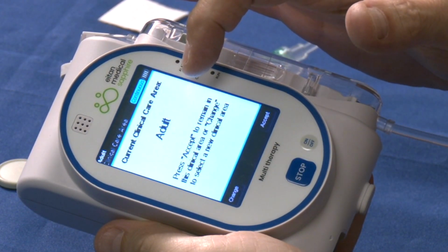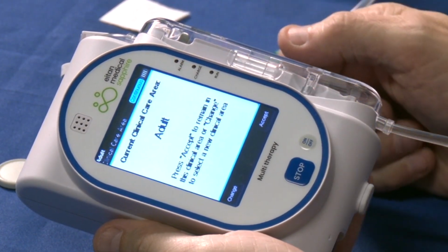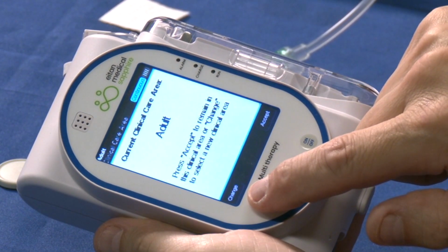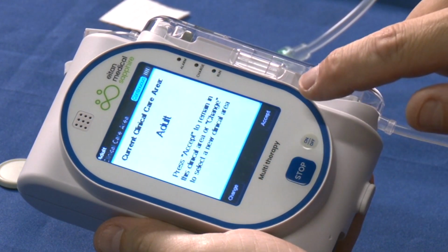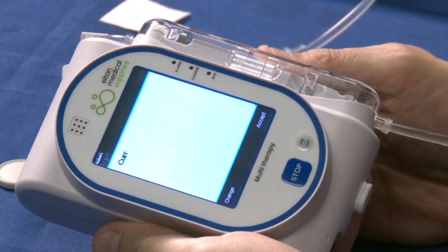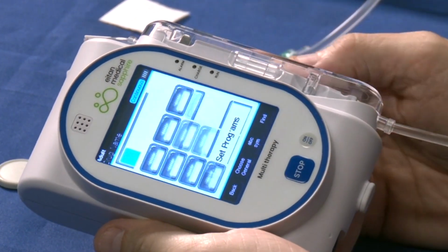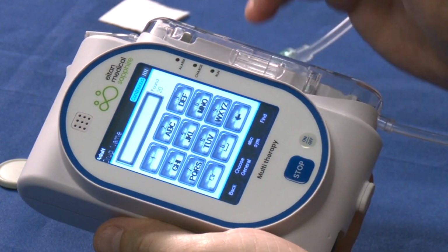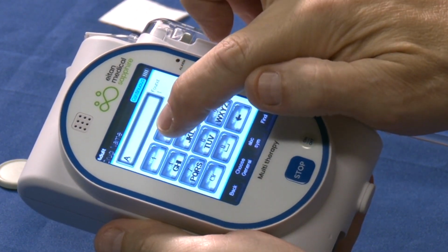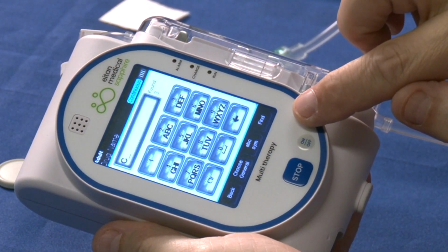Notice the clinical care area, adult or peds. To change the clinical care area, select Change on the bottom left and select the appropriate clinical care area. To accept the clinical care area as shown, tap Accept. Select New Infusion. Tap the 2 button 3 times to select the letter C like you would on an old cell phone. Tap Find.